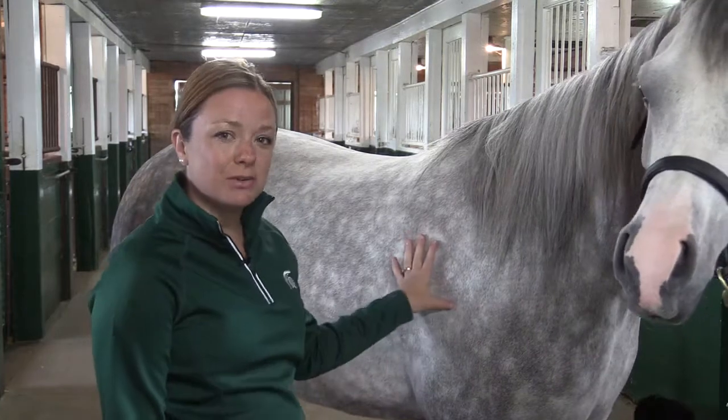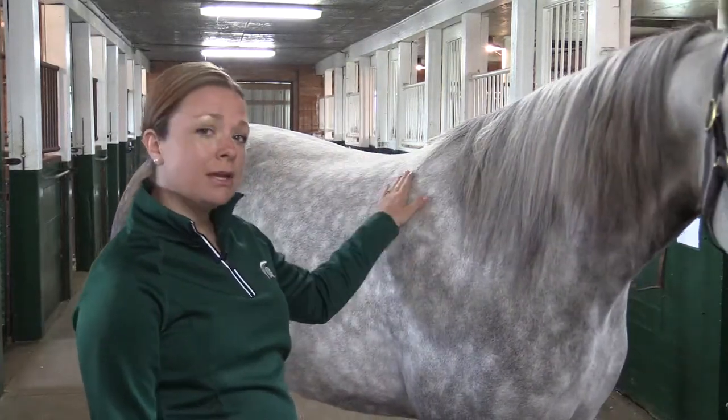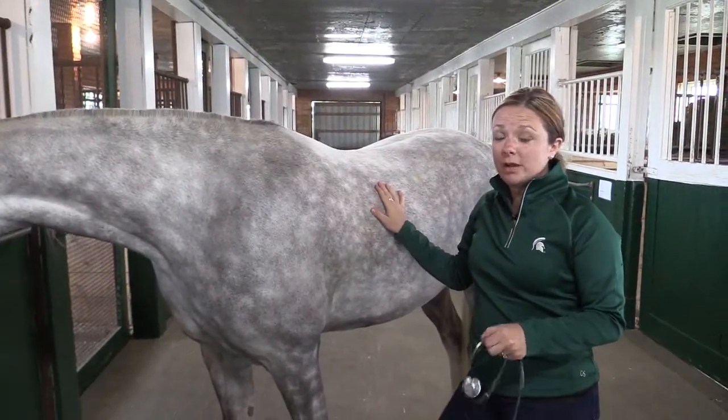Taylor Fabus here with Michigan State University Extension at the MSU Horse Teaching and Research Center. Striking Command and I are going to teach you about how to take some vital signs. Now let's talk about taking the horse's heart rate or their pulse.